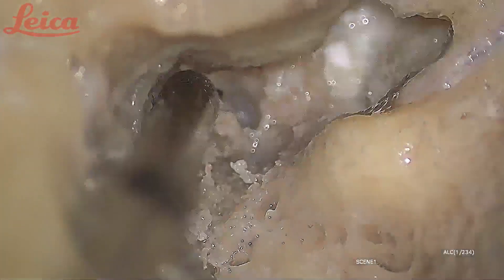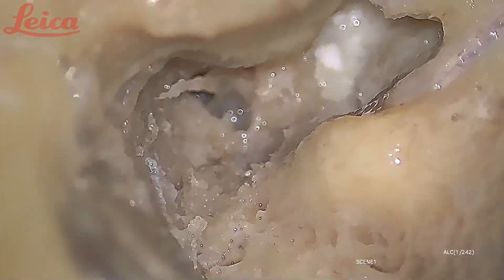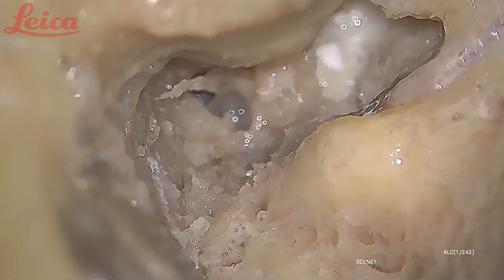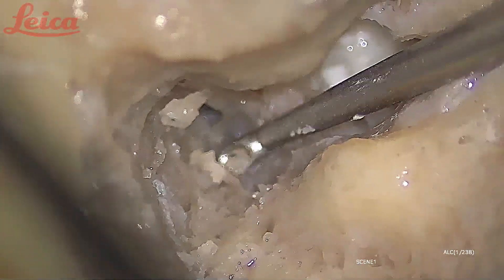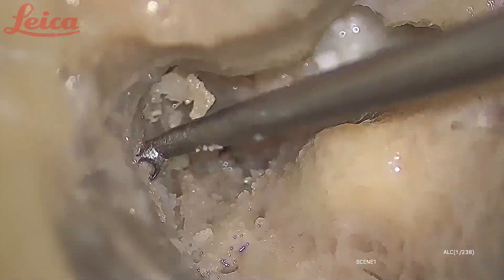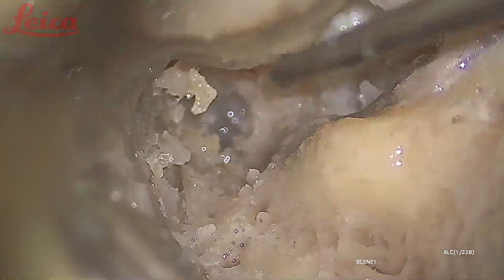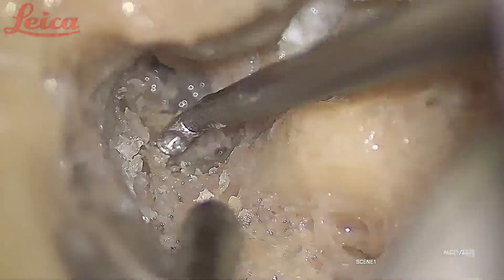The bone is a little hard here, so I am using a curet. These curets are very safe because posteriorly you can see they are quite blunt — so even if sitting on the nerve, they are not damaging any nerve fibers. The only thing is you should be careful about the direction of curetting; you should not go and hit the nerve. Always curet away from the direction of the nerve.